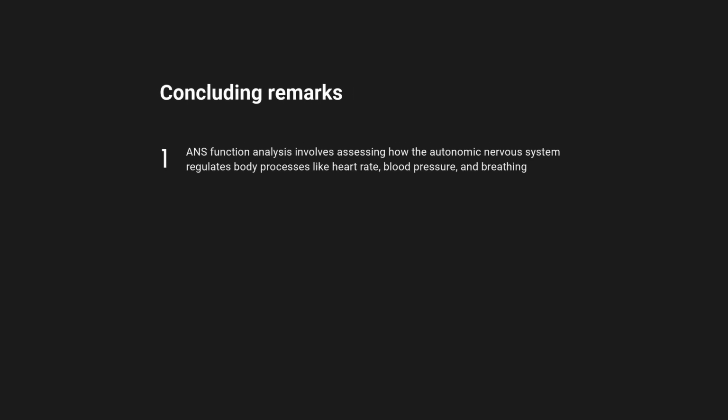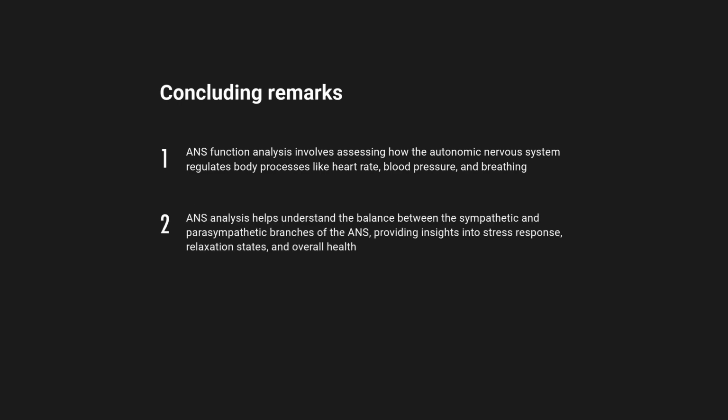Let's summarize this video. ANS function analysis involves assessing how the autonomic nervous system regulates body processes, like heart rate, blood pressure, and breathing. ANS analysis helps understand the balance between the sympathetic and parasympathetic branches of the ANS, providing insights into stress response, relaxation states, and overall health.